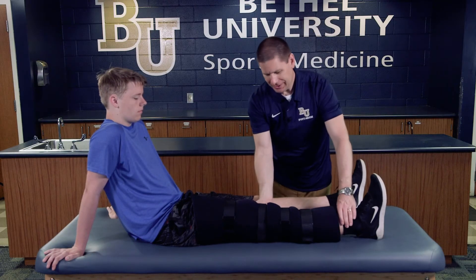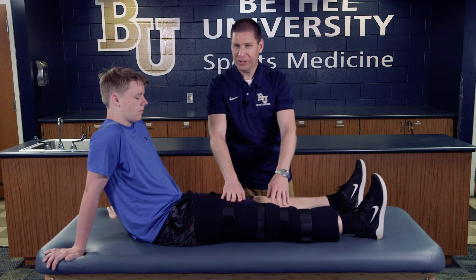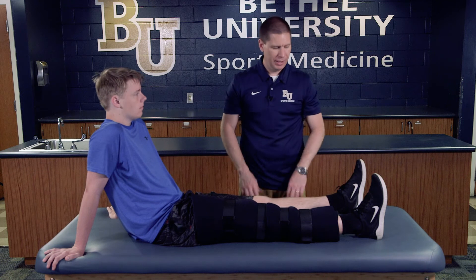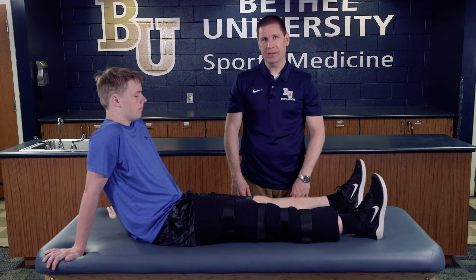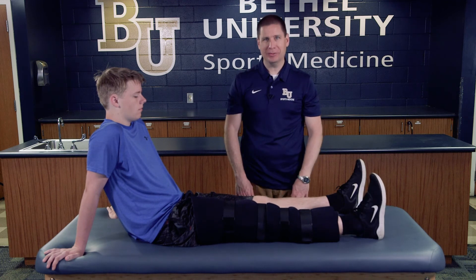Once it's on, you want to test it to make sure it fully immobilizes his knee. This is a challenging brace to walk on, so one of the next things you might want to do is fit your athlete with crutches so they can get to wherever they need to be.